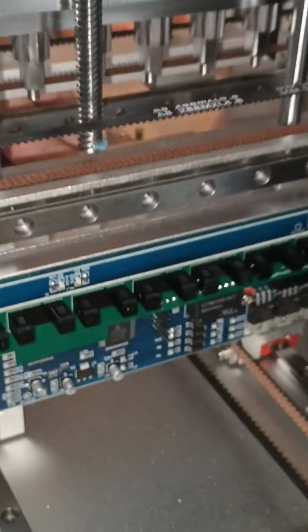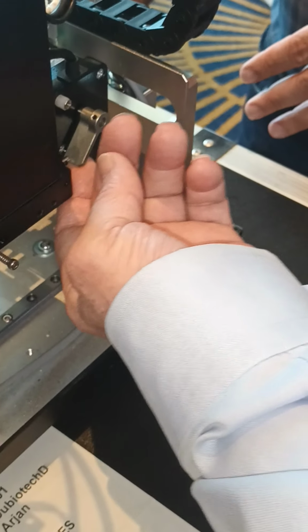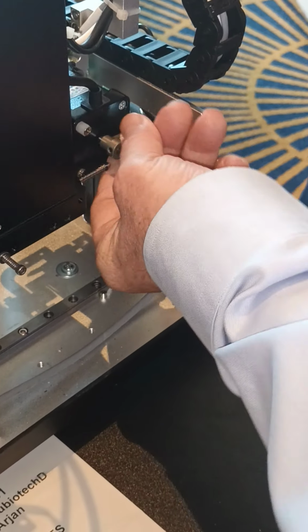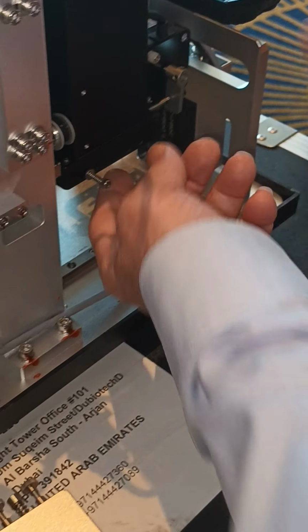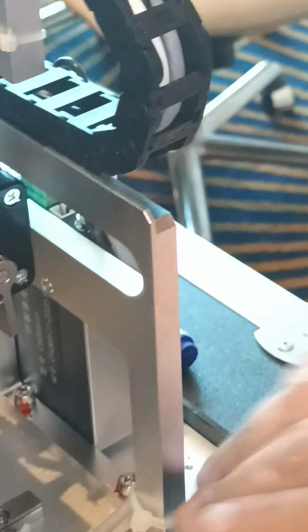So we start with the reader and the supply, and it has another part. Look, there are 2 things. It engages the reader, comes down, and then it's engaging it. It's 2 parts of it. To turn on the lamp. It goes down first. It comes down to open it. And then look at here. I'm engaging the lamp, reading. Okay, it's like a lens cover, and another thing, it serves as an engager. Like a shutter cover.